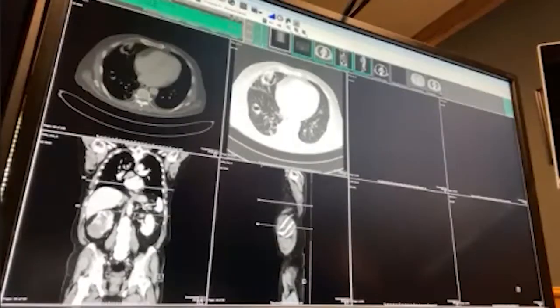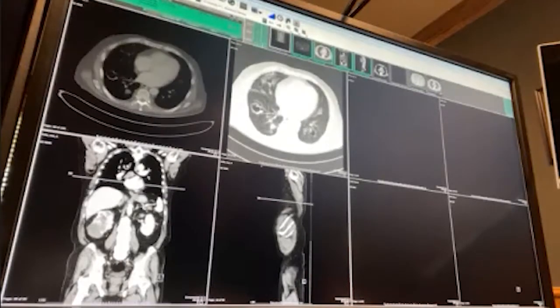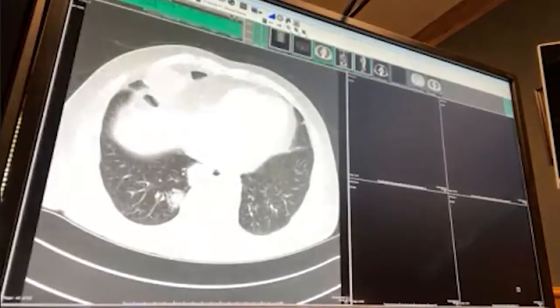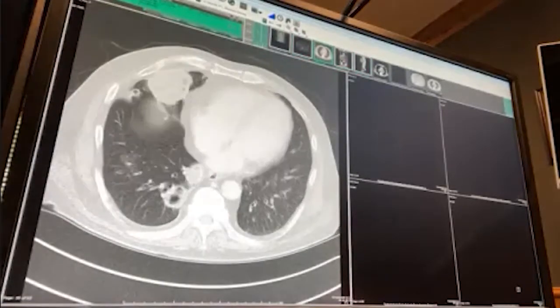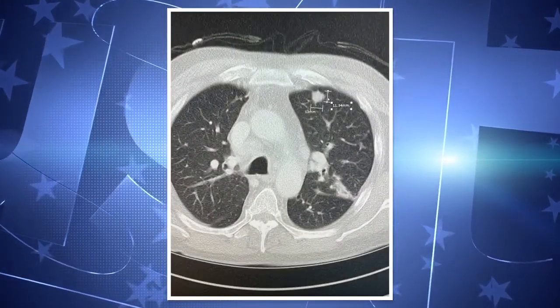Let's do it. So here we have a patient. This is one of their cancer follow-up screens to see how their treatment is progressing. The cool part we can use, like we were talking about with computers, is we can change what we call the window and level. So we can change these to where you can see the bones better or the soft tissues better, like the heart, or unfortunately in this case, we can see these big masses in their lungs here. And these are unfortunately metastases from their kidney cancer. So their kidney cancer has spread.